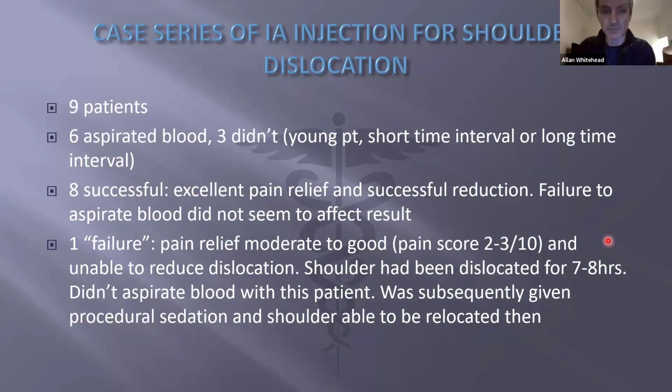He was subsequently given procedural sedation as a backup plan, and the shoulder was able to be successfully relocated a few hours later. So I think that's the end of my presentation. Oh, there was one other interesting comment I remember that I wanted to pass on.